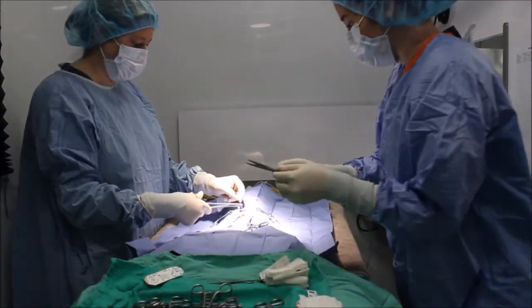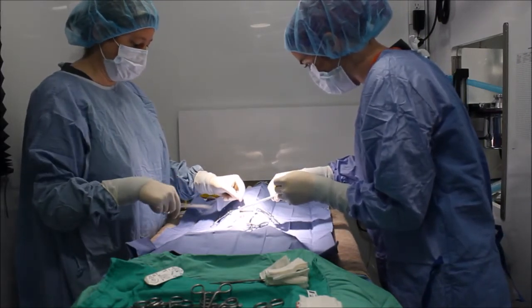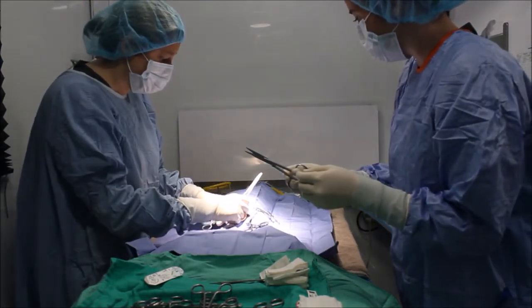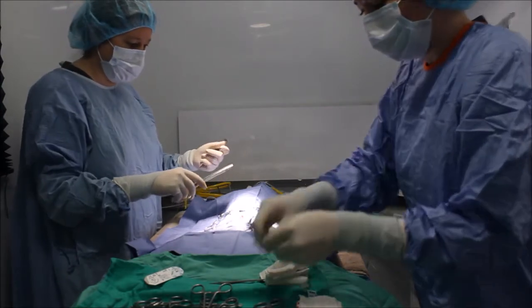What I'm going to do now is just cut the suture for her, and then I'll add a mosquito clamp.